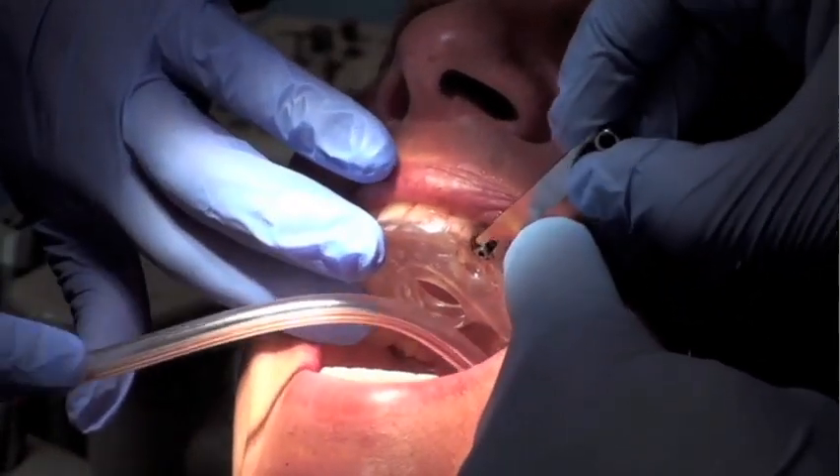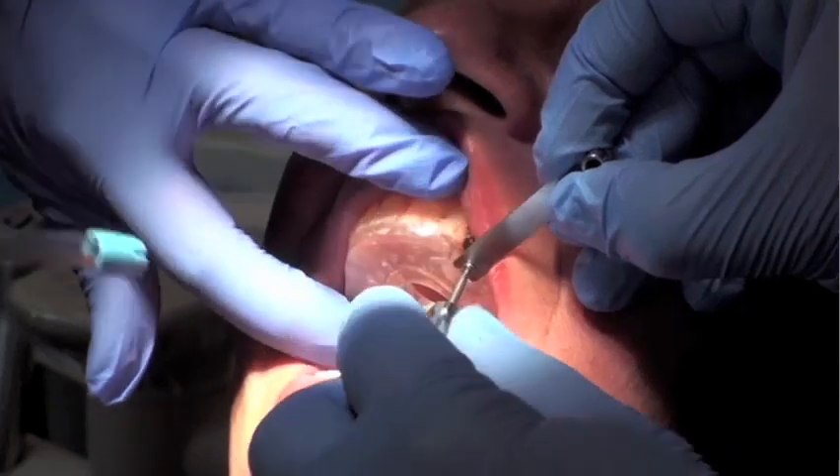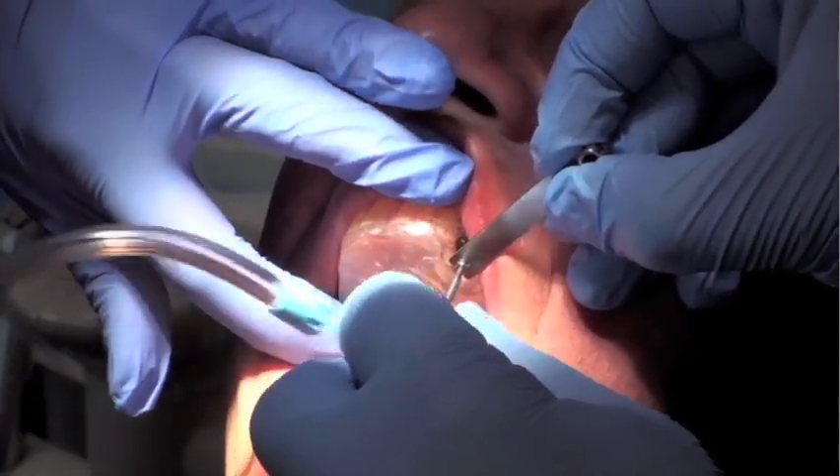Once the screw is released, a key is used to back out the screw completely so that I have access to the screw hole of the implant holder.